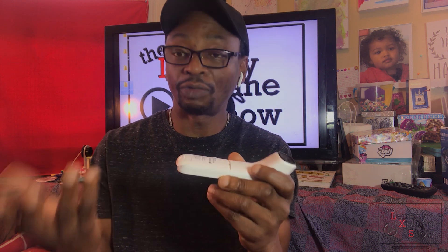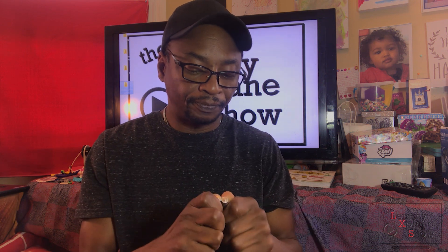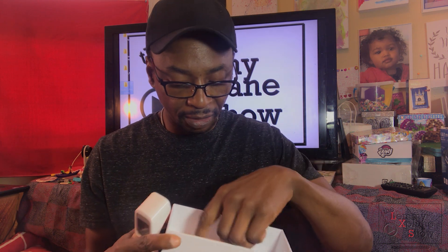I'm going to put the batteries in the thermometer and give it a test run. It did come with batteries, which is a great bonus — two triple-A batteries. We're going to put those in.